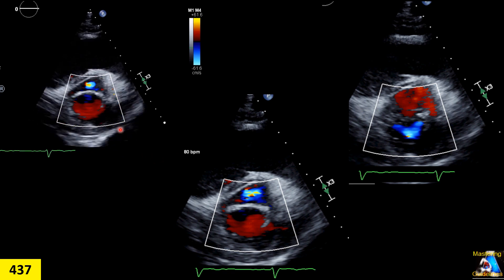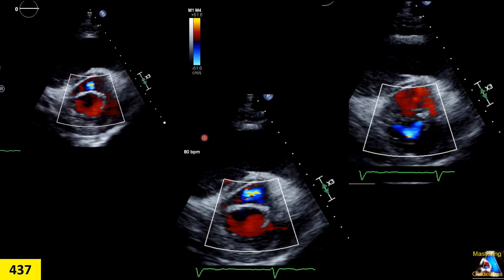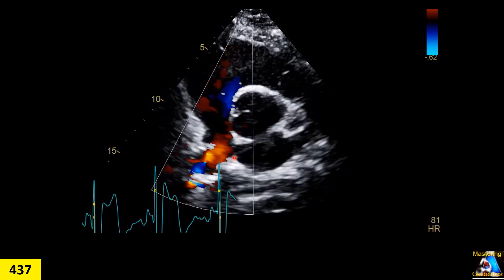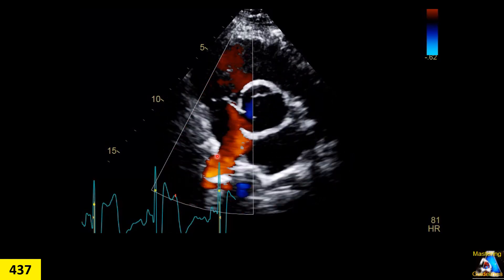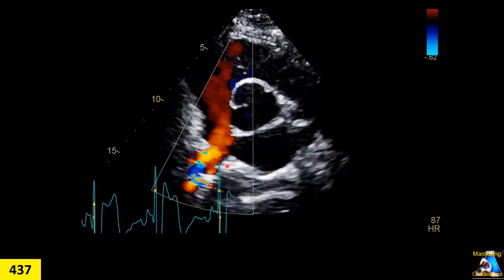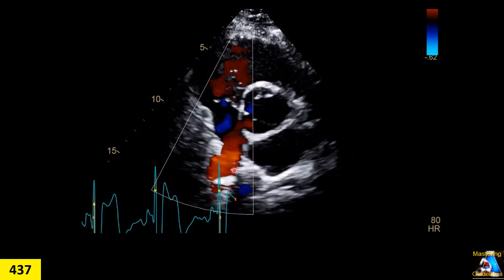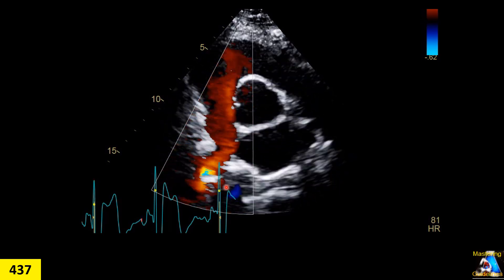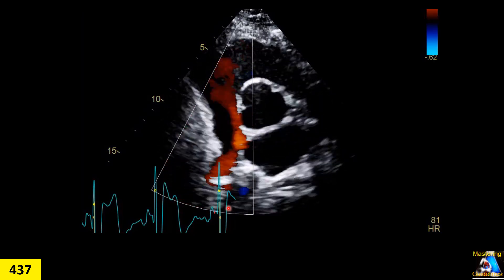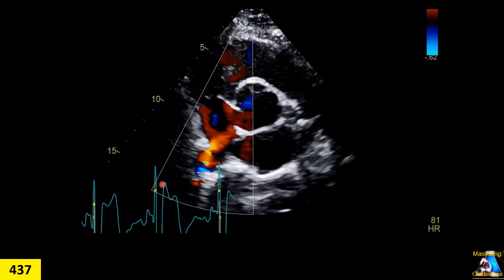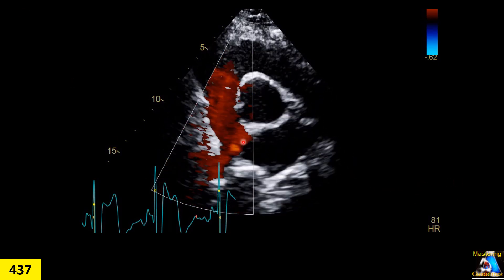Here we have another color Doppler with PISA. Can you mention what this structure is, or more accurately, which vessel or area is this one? Do we use this view and focus more attention on it? If yes, at what situation or condition do we go for this view and more accurately investigate that area?